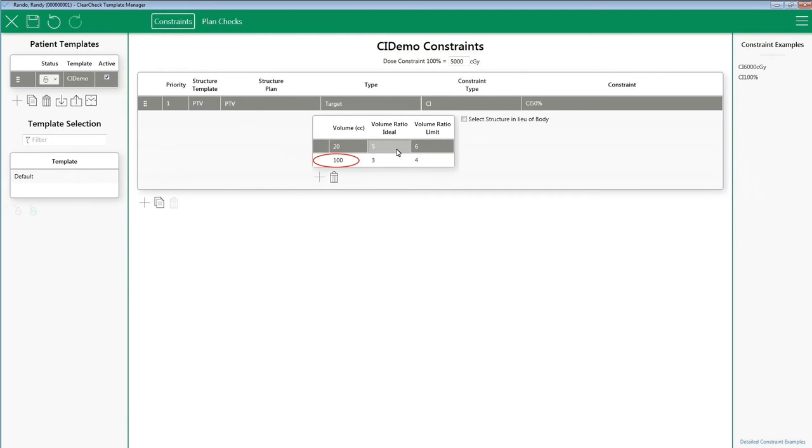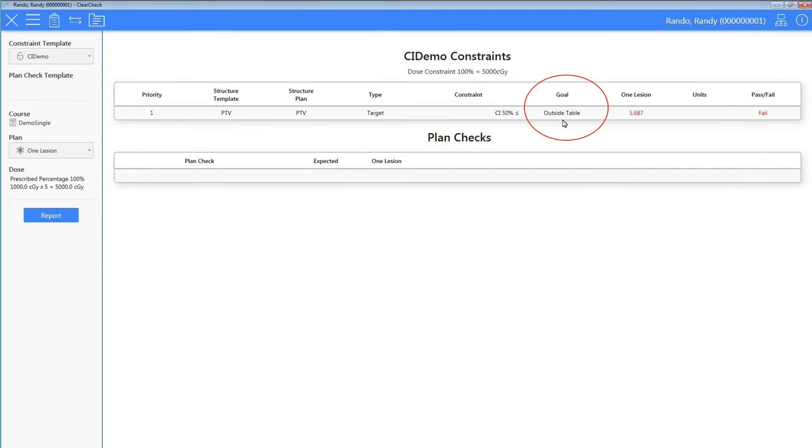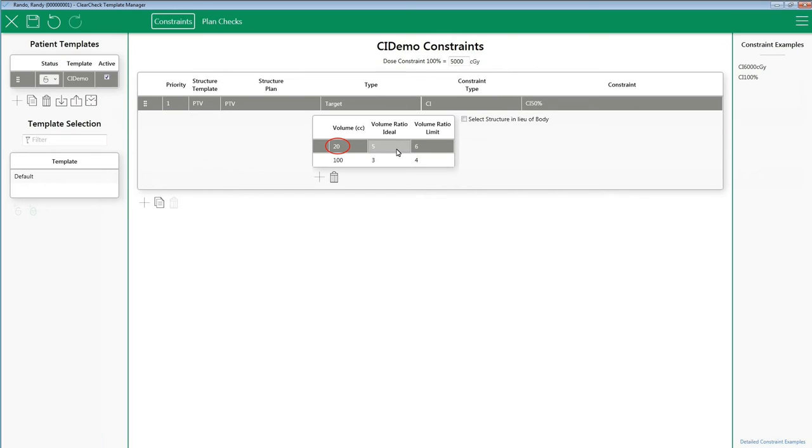If I have a volume that is bigger than 100 CC, meaning it doesn't show up on the table, then the software will simply report outside table with a goal. So if you see this, it simply means your volume exceeds the volume you built in your table. If you have a target volume that is smaller than what is built in the table, then the smallest volume row with ratio ideal and ratio limit will be used.